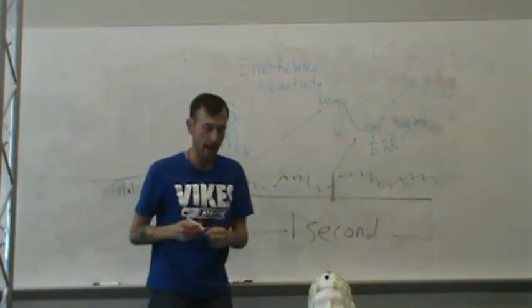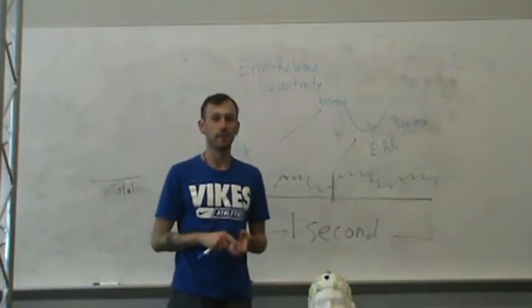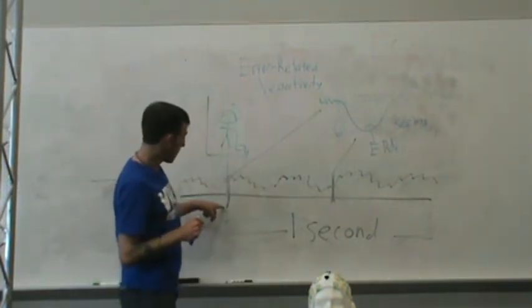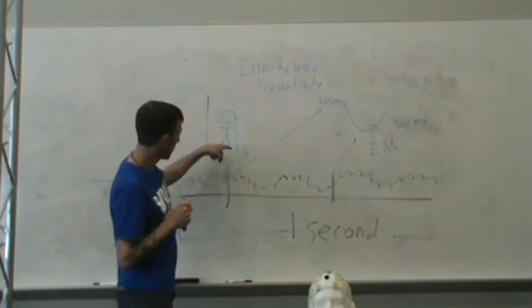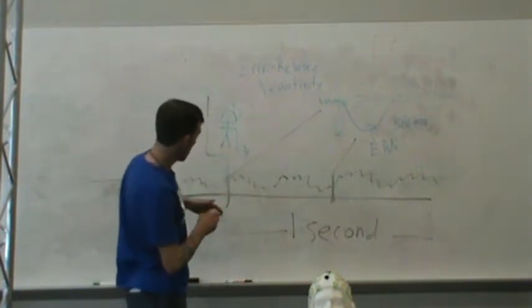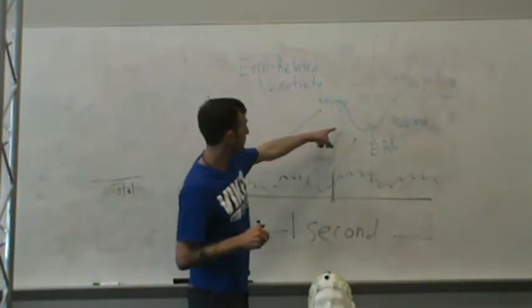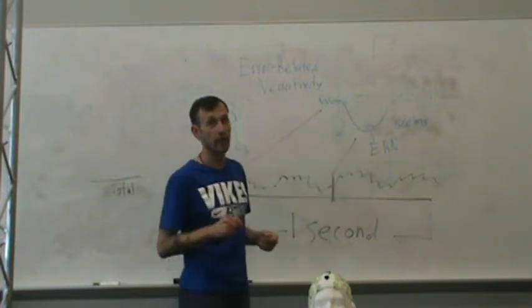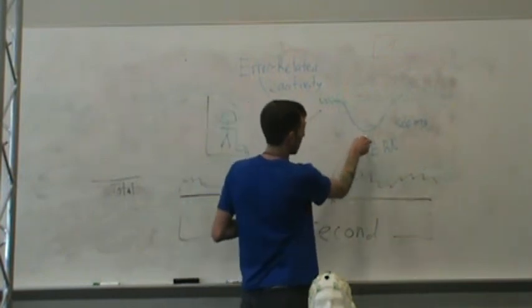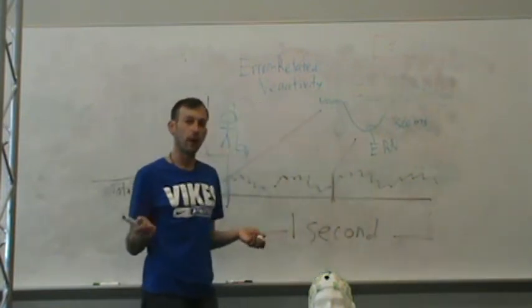missing the putt. So I go ahead, I swing the club, and as soon as it contacts the ball, I know that I hit it way too hard. That moment that I realized I hit it too hard, that I contacted the ball with the club, that's going to be time zero here. We can go and blow that up, and we get our event-related potential. And what you'll notice is when time zero corresponds to an error, in this case, me mishitting the ball, I get this big negativity in the first 100 milliseconds after I hit the ball.